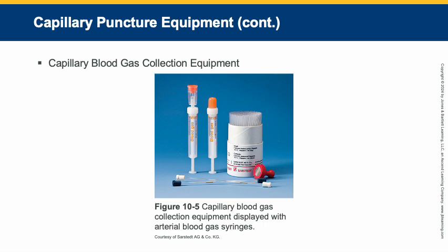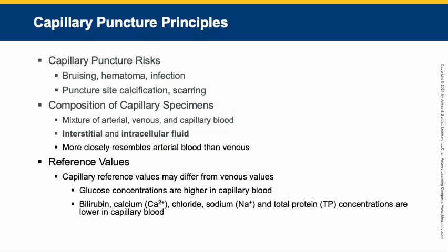This is just a picture of your capillary blood gas collection equipment. Capillary puncture risks. Although mostly minor, there are risks associated with capillary puncture. Some examples are bruising, hematomas, infection, puncture site calcification, and scarring.